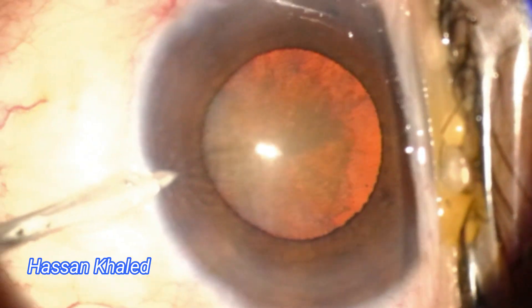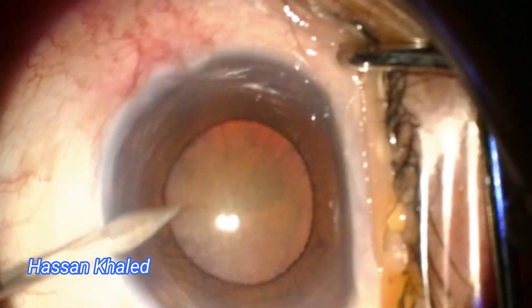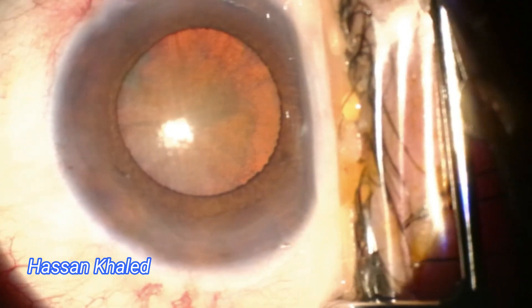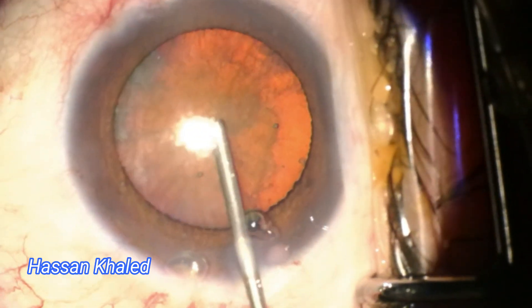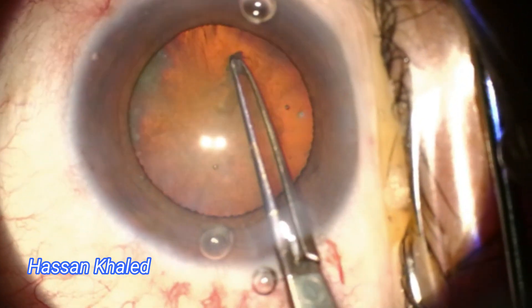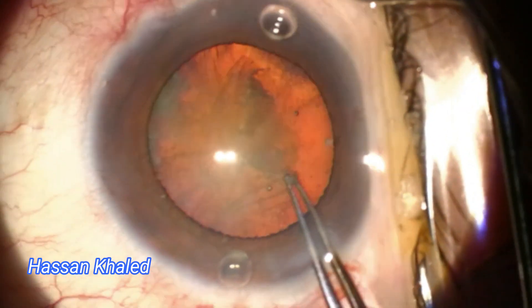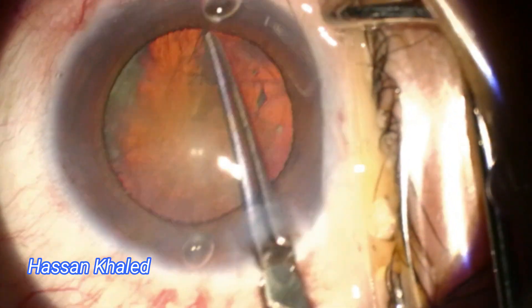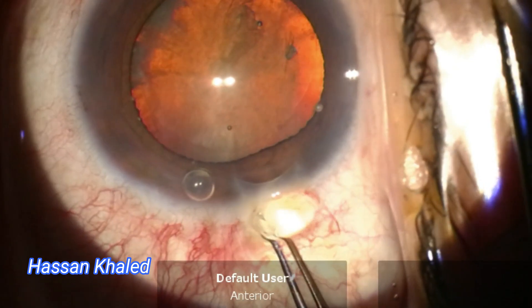I started with two paracenteses, then a 2.4 mm clear corneal incision, injecting intracameral mydriatic agent to dilate the pupil, then using the dispersive OVD as we can see, then starting the capsulorhexis. I have a very good dilated pupil, and the capsulorhexis is around 5.5 mm in diameter.